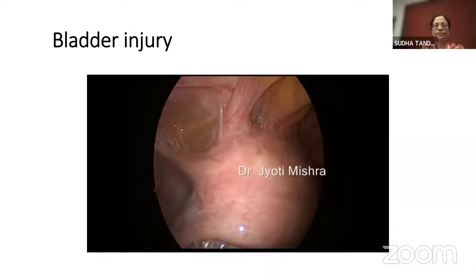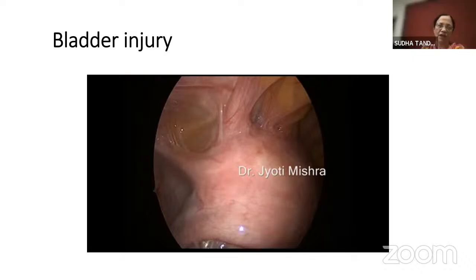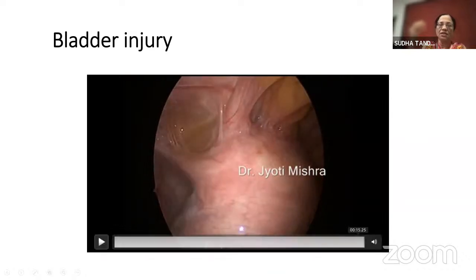Yeah, so I think one has to be very careful, and a good amount of pulling the uterus down. Good traction, and only a myoma spiral gives that much traction as compared to any vaginal approach. And if you can go a little slowly, with the lateral window technique, try to dissect the cornual structures as much as you can, but be a little slow.